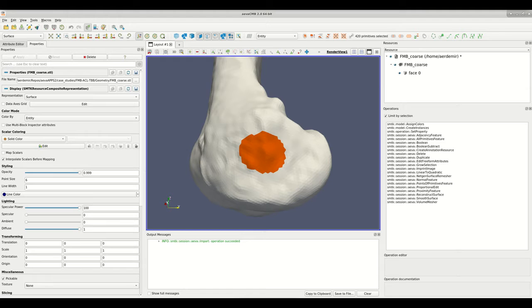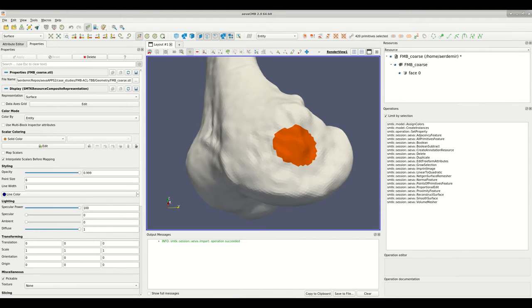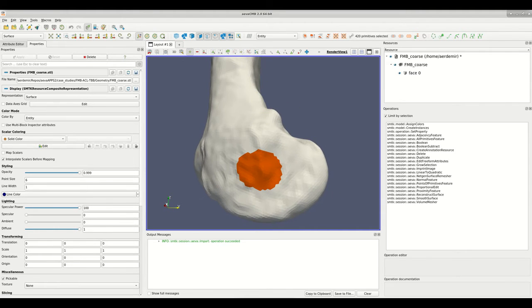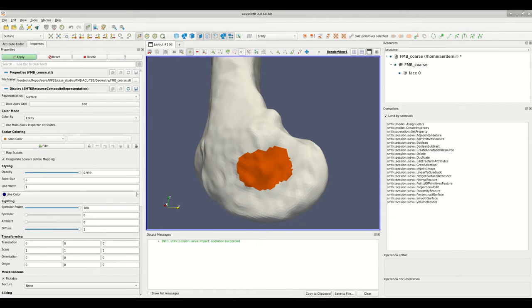To select a region of faces, I first activate the freehand selection tool. I can draw on the bone as I press the left mouse click and the region is selected when I release the button.